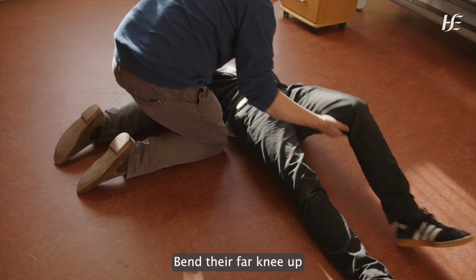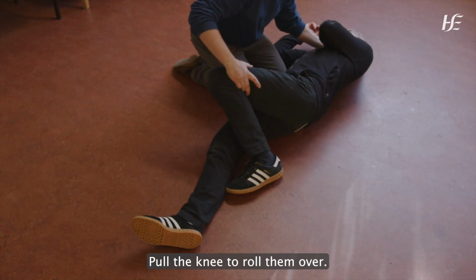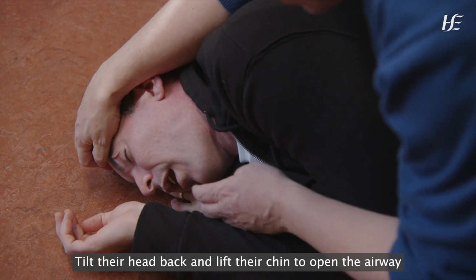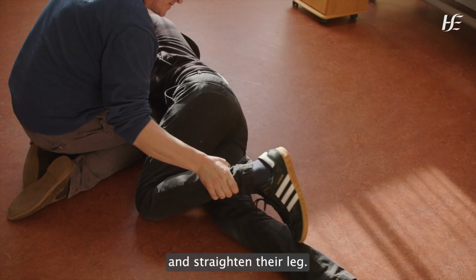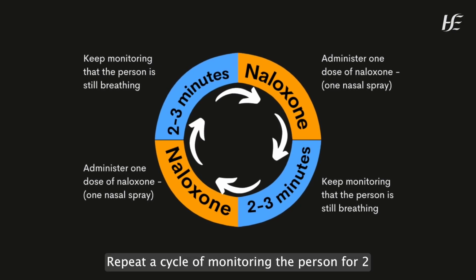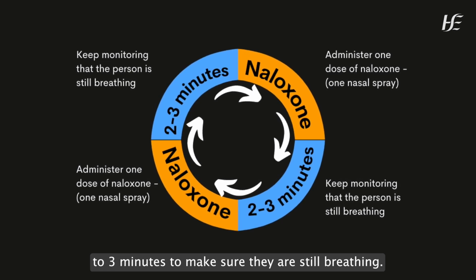Put the back of their hand to their cheek and hold it there. Bend their far knee up and tuck their foot under their other leg. Pull the knee to roll them over. Tilt their head back and lift their chin to open the airway and straighten their leg. Repeat a cycle of monitoring the person for 2 to 3 minutes to make sure they are still breathing.